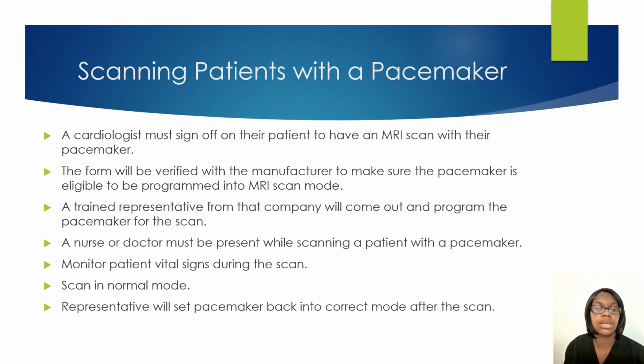So whenever you are scanning a patient who has a pacemaker, I know at the hospital I work at, a cardiologist must sign off on the patient's form stating that they can have the MRI scan, and they will fill out the manufacturer information, the pulse, they will fill out everything on the form to state that the patient can have the MRI scan. At my job, we have a nurse that comes down or comes in to monitor the patient while we are performing the scan. And whenever we do, we monitor their vital signs during the scan.